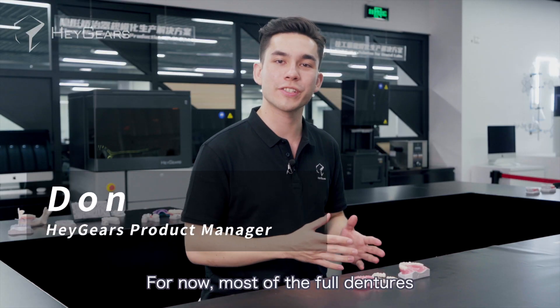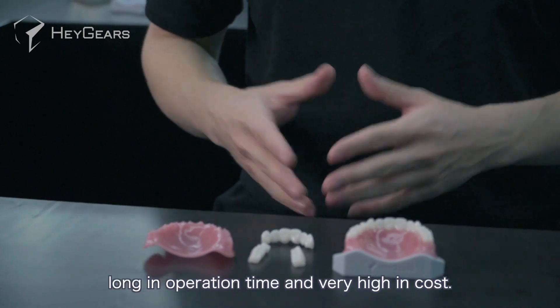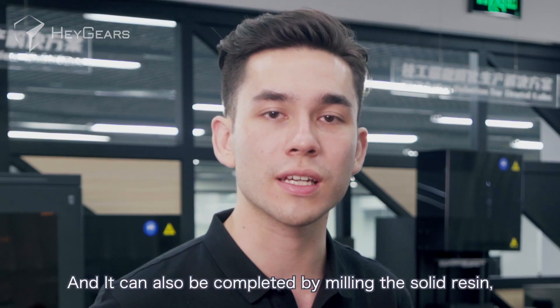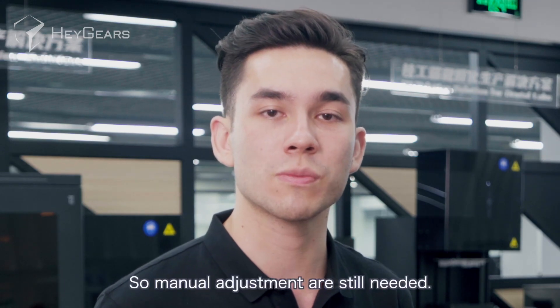For now, most of the full dentures are still fabricated by traditional manual work, which are very complicated, long in operation time, and very high in cost. And it can also be completed by milling a solid resin, but it takes a long time and part of the front tooth area are not completely cut, so manual adjustments are still needed.